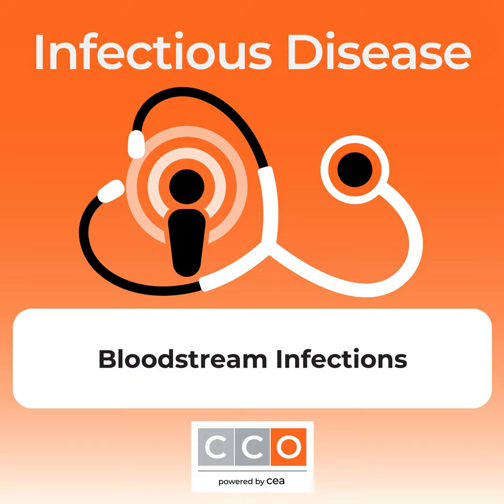And although we've had a lot of advancements in culture media and these automated testing profiles that have improved the sensitivity and turnaround time of blood culture results, they are still inherently hampered by several limitations that can make it take up to 5 days to get full identification and susceptibility for our bacteria. And so, in the setting of something like contamination with skin flora for our cultures, this can really delay our timing of understanding what is truly happening for our patient. All the while, these patients might be continued on empiric broad spectrum antibiotics rather than the optimal targeted therapy that we would like to have a patient on.